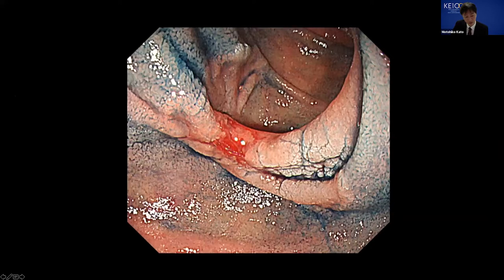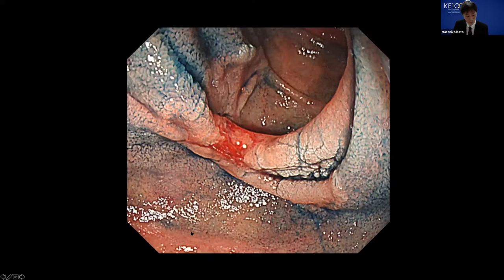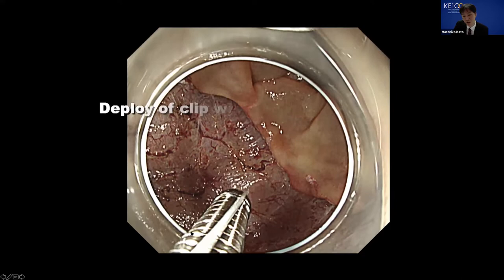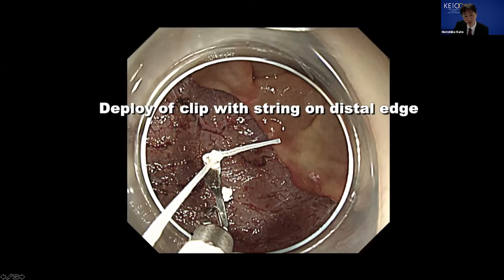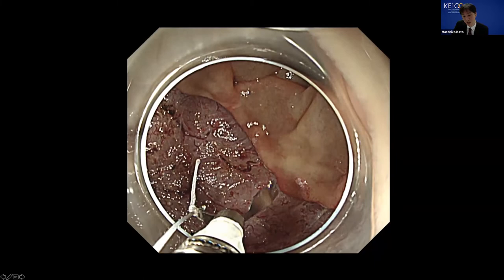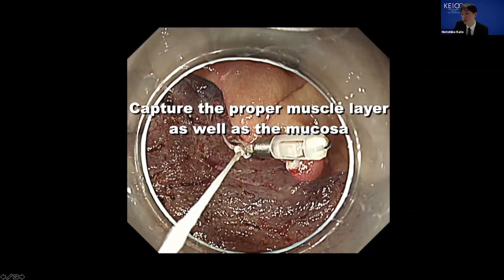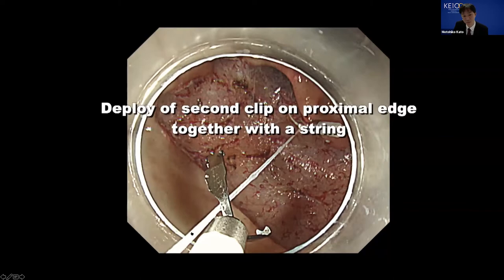We invented a closing method using the clip with sling. I'll show the actual procedure of the sling clip suturing method. This is a region of about 40 millimeters in diameter in the descending duodenum. After ESD, about a 50 millimeter mucosal defect was created. The first step of the clip with sling method is deployment of a clip on the edge. The first clip is deployed capturing the proper muscle layer as well as the mucosal edge.